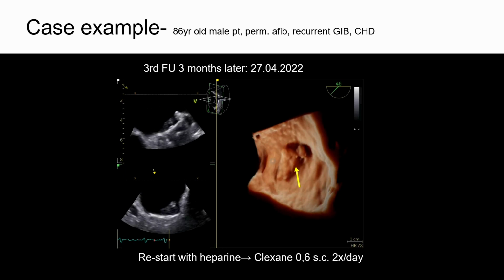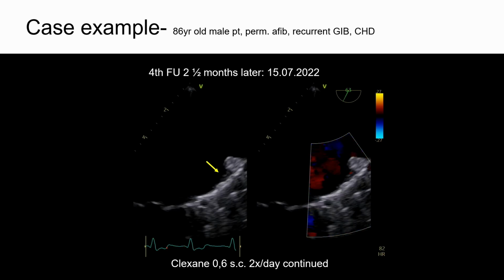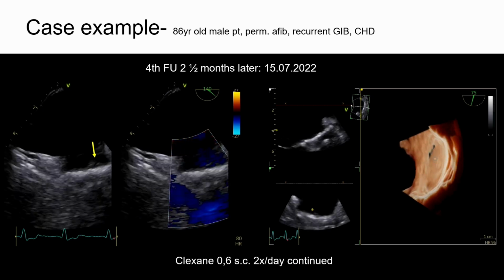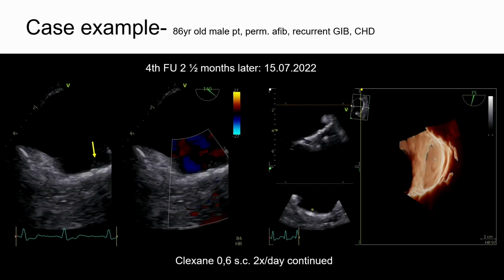It resolved, but not completely. If you look at this area, you still have some thrombus formation here in this area. So heparin was continued. And 2.5 months later, the thrombus resolved again.